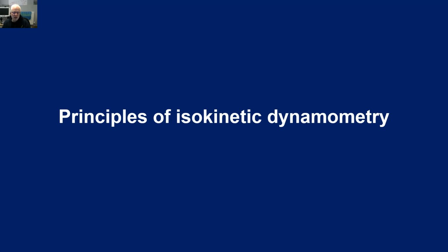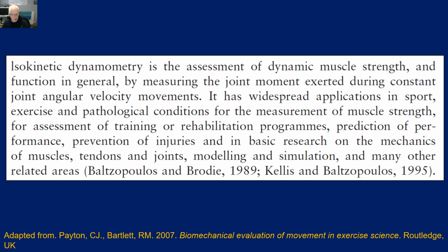So we'll start off with examining the principles of isokinetic dynamometry, and we'll do that from a perspective of starting with what it is and then getting into an understanding of how we set the dynamometer up and what the dynamometer is recording. So we'll take this paragraph here.